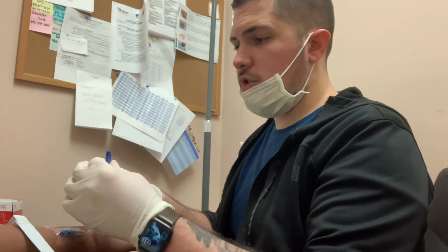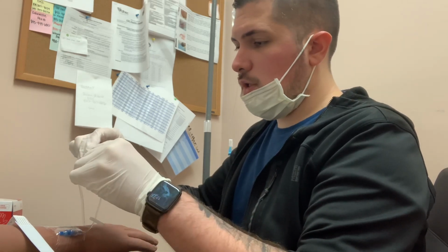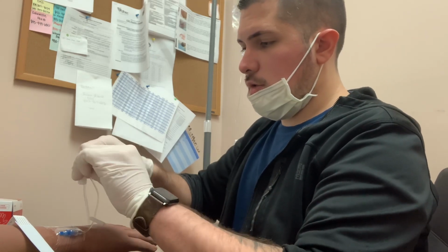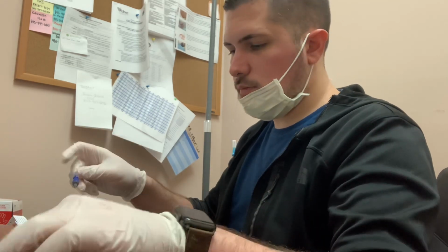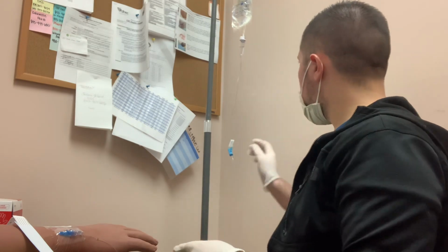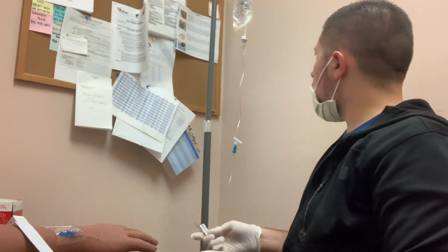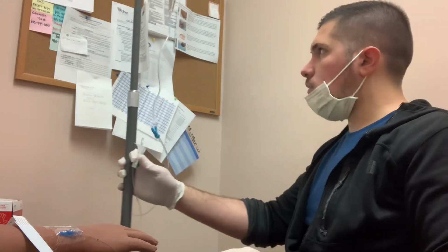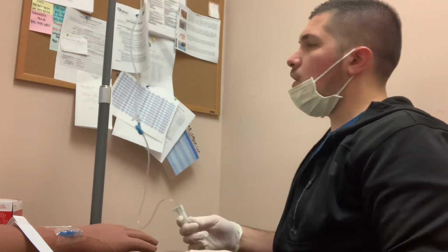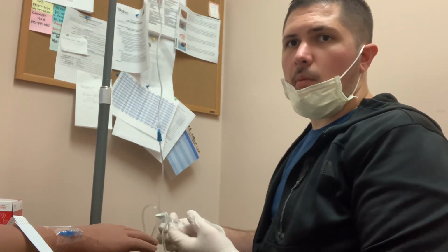We're going to give it time to dry. Then we're going to connect the line. We're going to open the clamp, and we are going to count our drops to get 21 drops per minute.